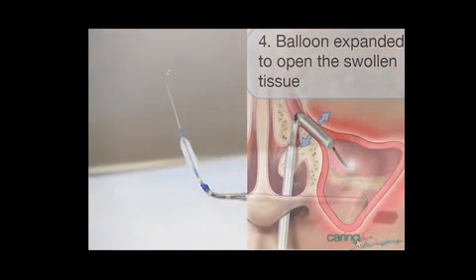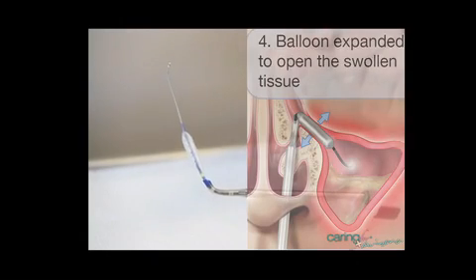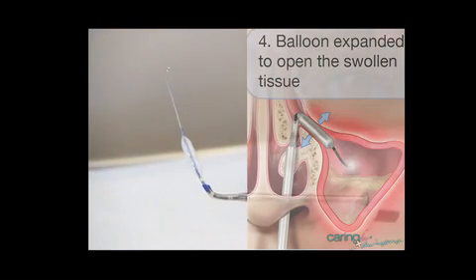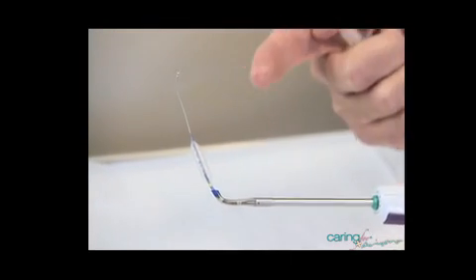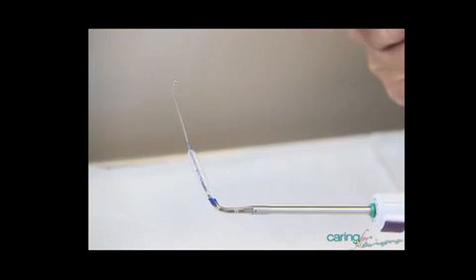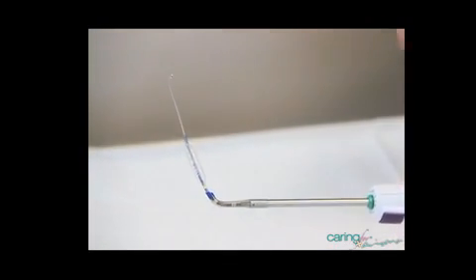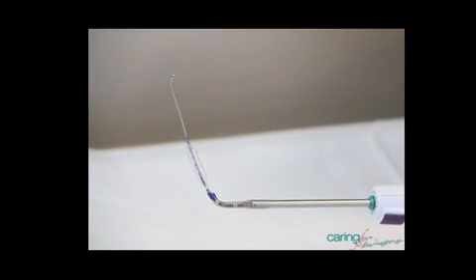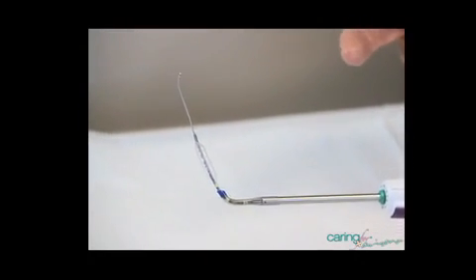The balloon is quite firm and it will dilate the opening of the sinus, just as if we were trying to remove tissue or punching a hole in the sinus. Now we just use the balloon to dilate the opening. By using the balloon to dilate the opening, there's less trauma and less risk of scarring, we believe. Long-term reports have shown the opening that we produce with the balloon lasts as long as punching a hole or cutting a hole into the sinus.